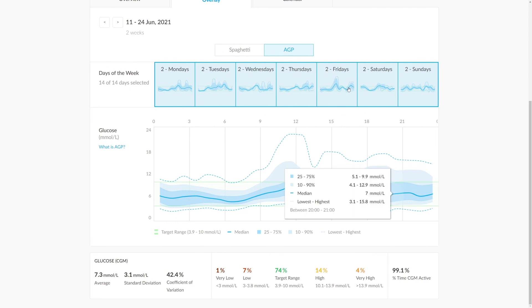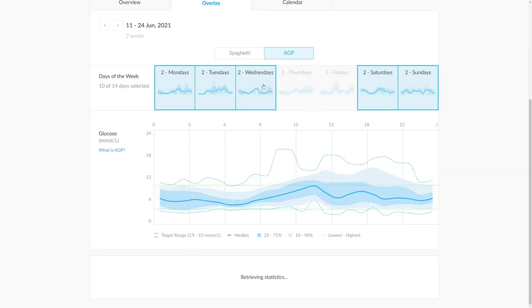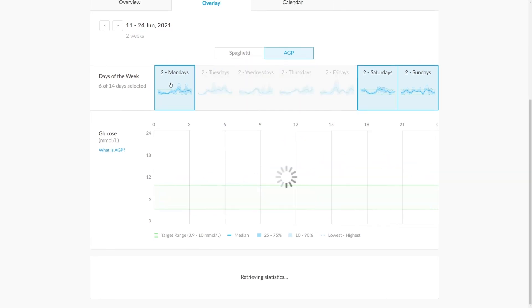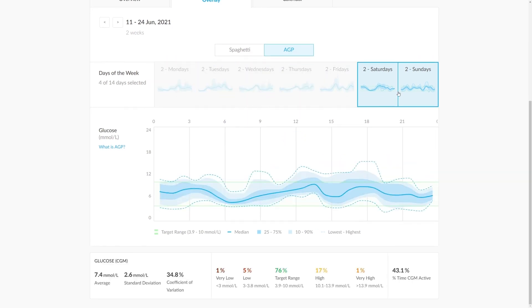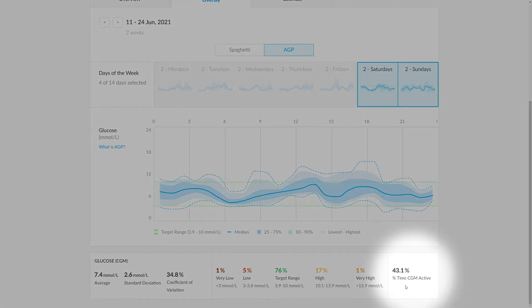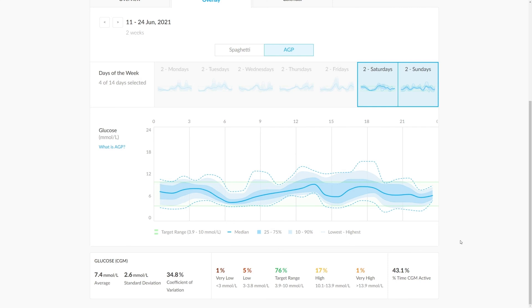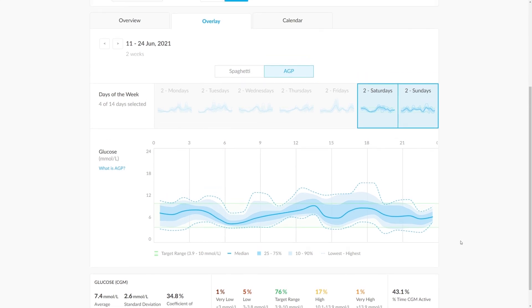Therefore, we can see that for instance, when we select the weekends, the CGM has not been as active as during the week, and that might be something a healthcare professional would want to address.